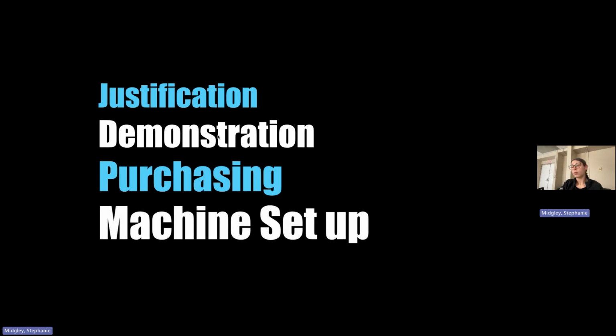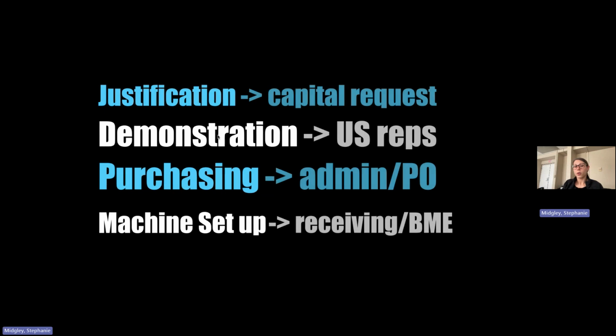And then after purchasing, right, the machine setup. So whose name is going to be on the delivery address for the machine? Do you need to contact receiving to know that a machine is coming? Who's coordinating the tracking number so that you know it's coming? Who makes sure that it's going to Biomed? Who's going to send it from receiving to Biomed? Does biomedical engineering know how to set it up, what Wi-Fi it needs to get to, how to connect it to PACS, how to connect it to the workflow? So all of this goes into getting a new machine as well.